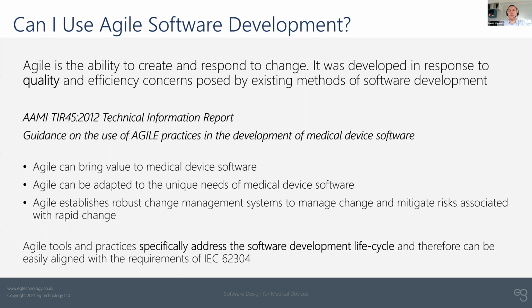There's plenty of literature out there talking about the benefits and the compatibility of agile development processes with the development of medical device software. Because when you dig into it, agile is based around quite a robust change management process. It's about controlling the software development process overall, and that's really well aligned with the objectives of 62304 and the product development lifecycle.